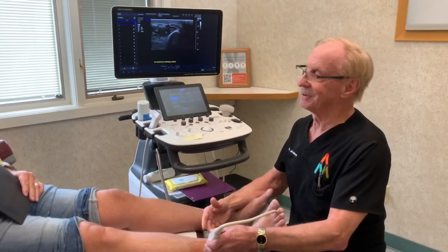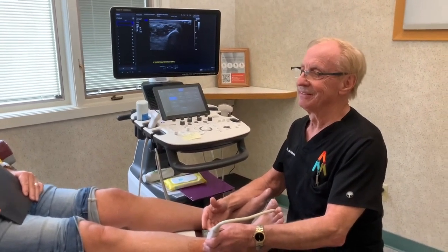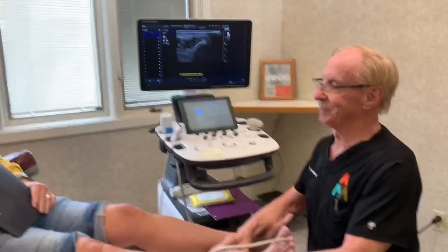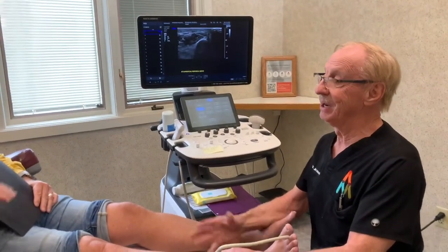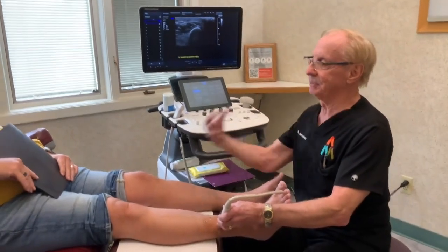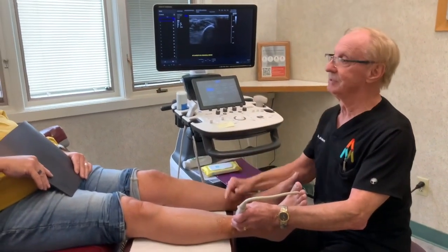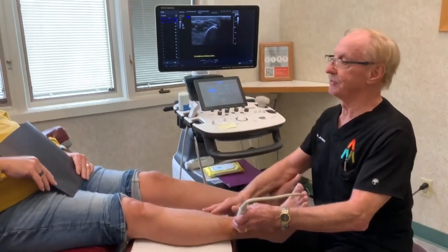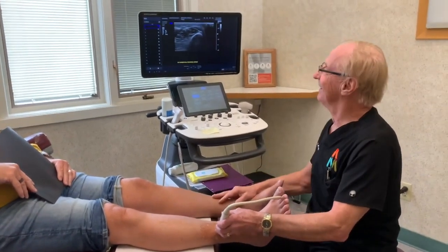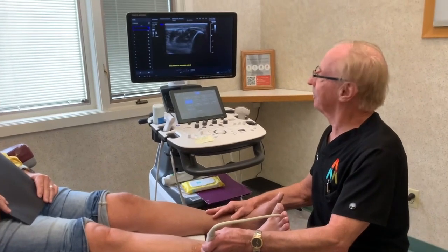It's not as bad as it gets at night, but I've had people even jerk when this happens. Yours is more like it's stimulating you to want to get up and move, right? Yeah, that's really interesting.